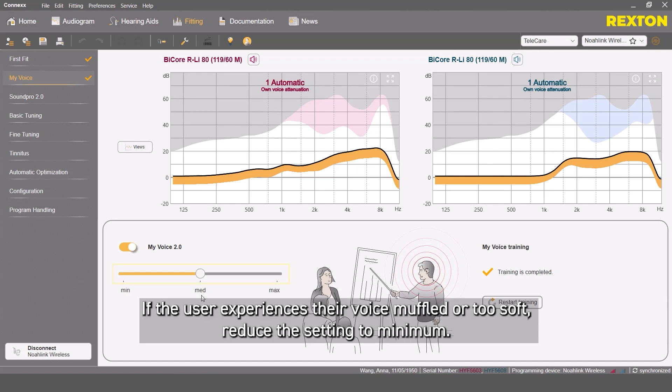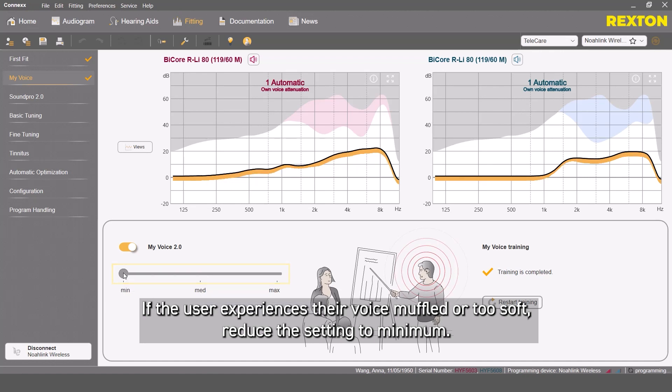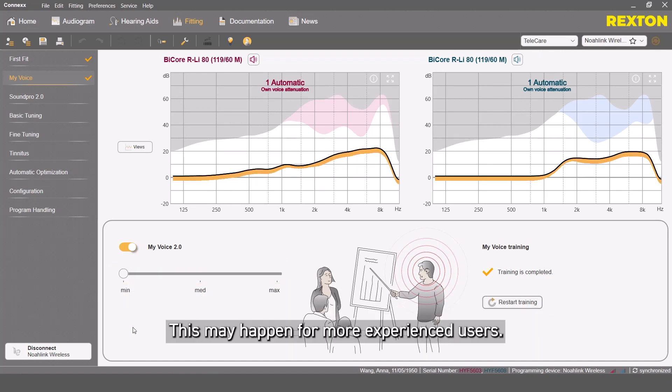If the user experiences their voice muffled or too soft, reduce the setting to minimum. This may happen for more experienced users.